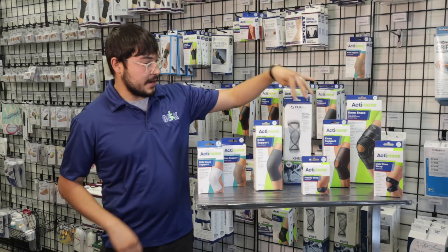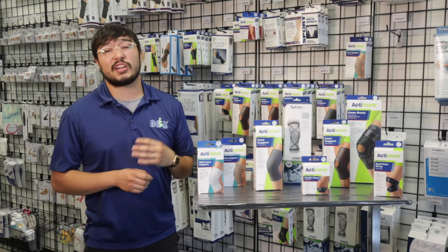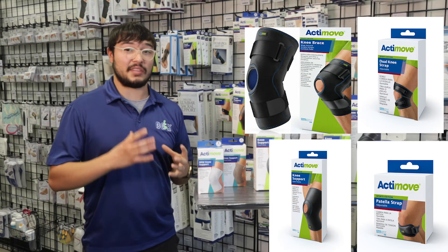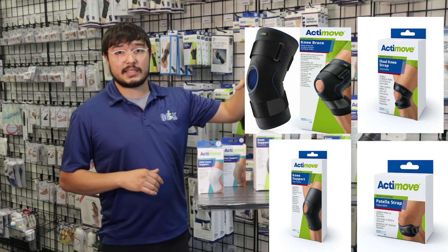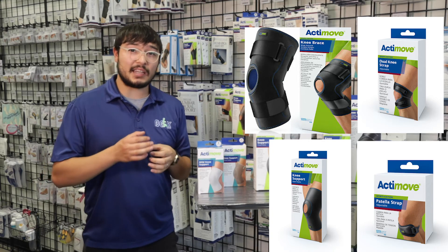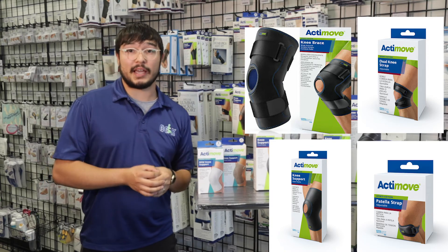The last four over here are going to help with your patella and also with your entire leg around the knee area. What I mean by patella is that little bone right in the middle of your knee — so a few of these help keep that in place.